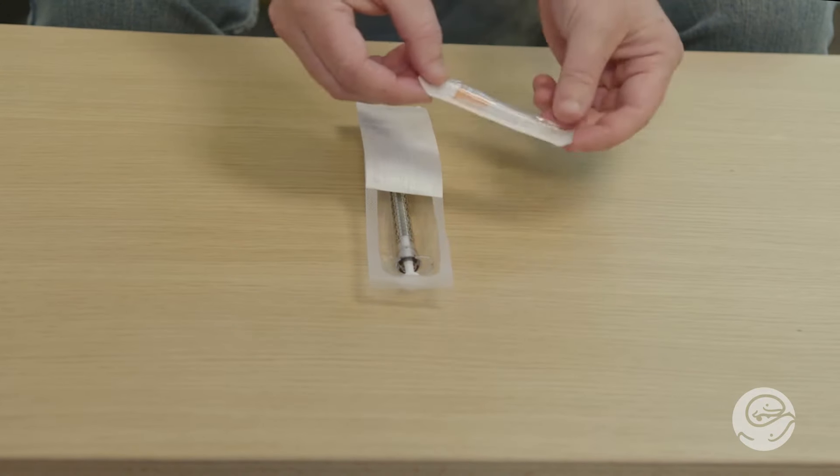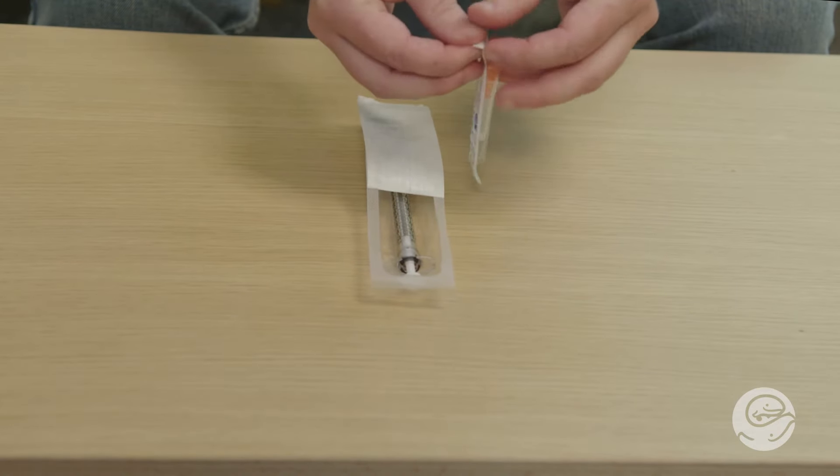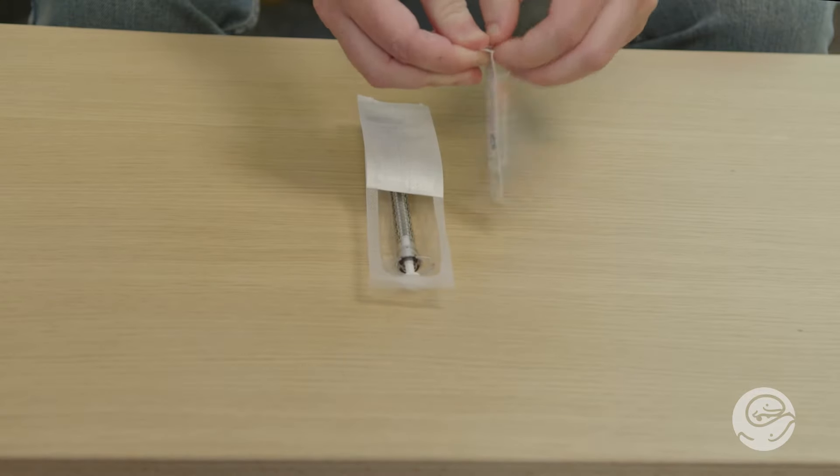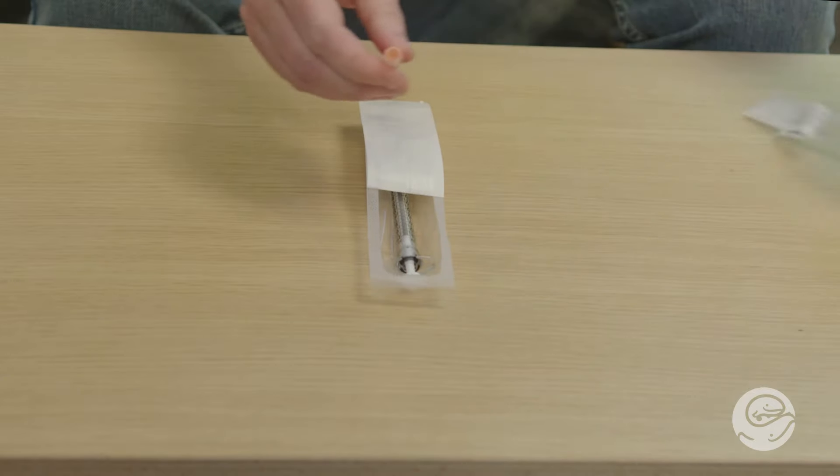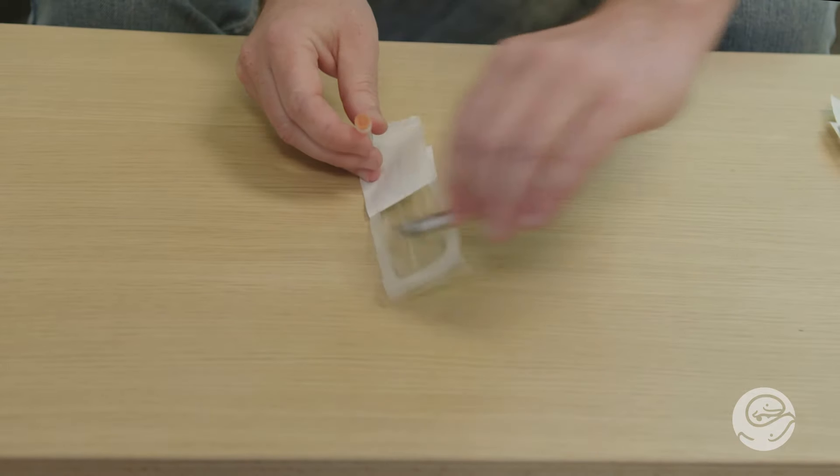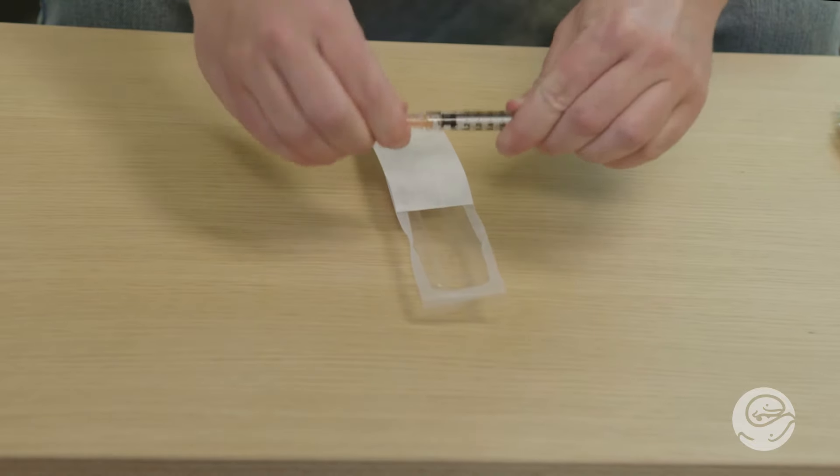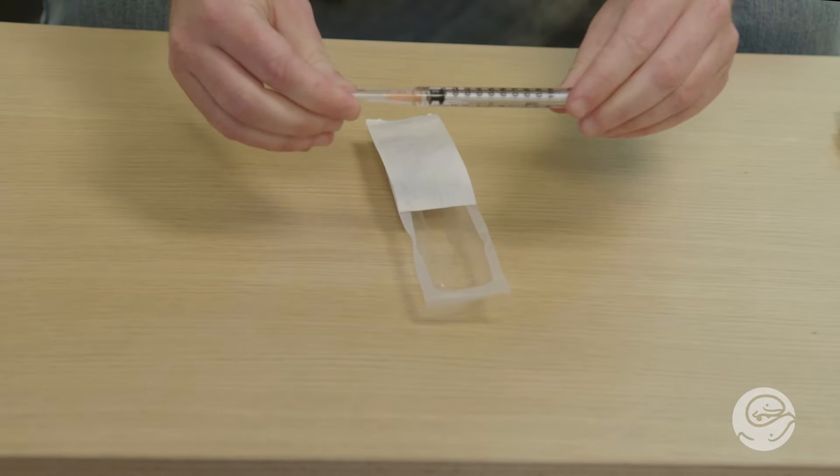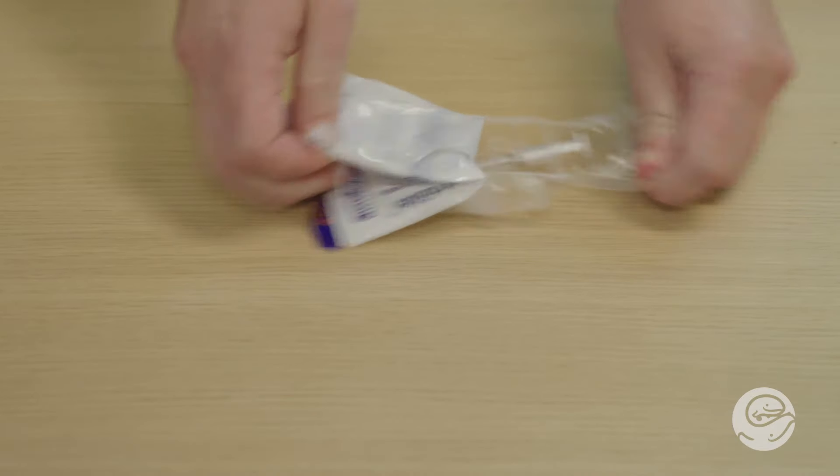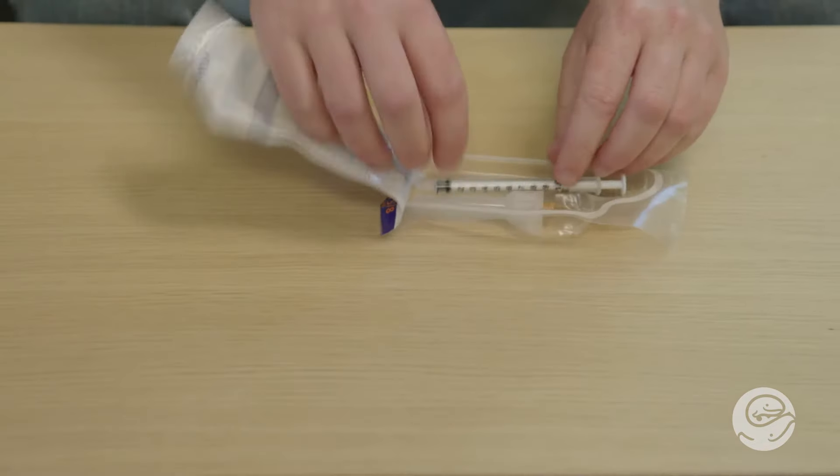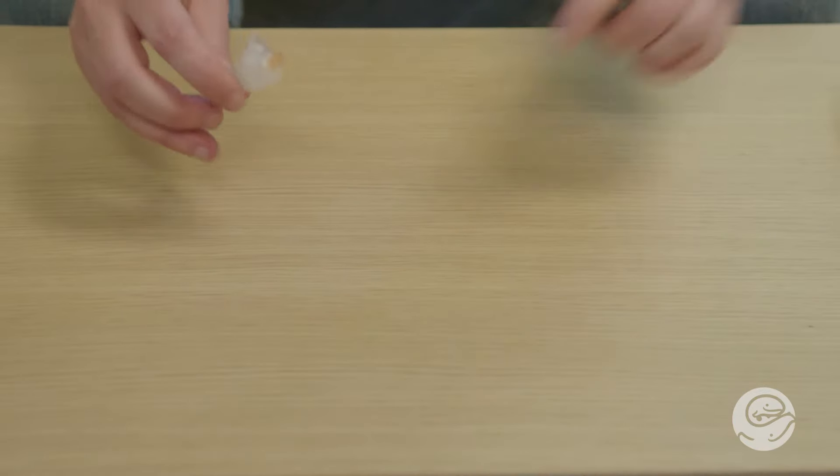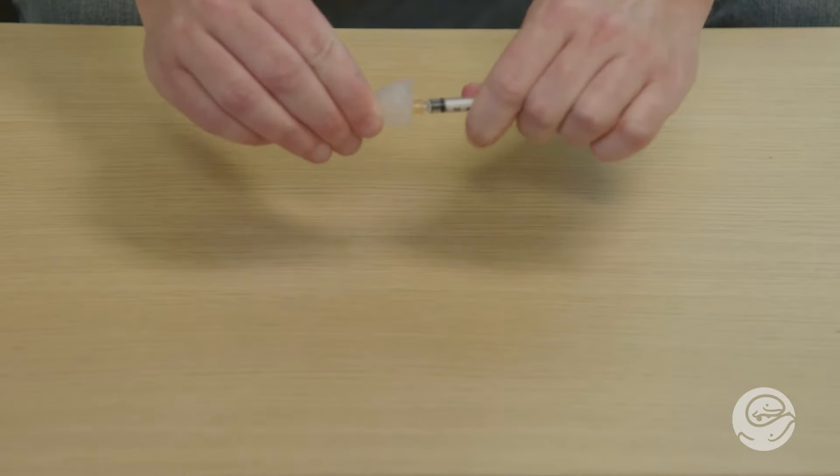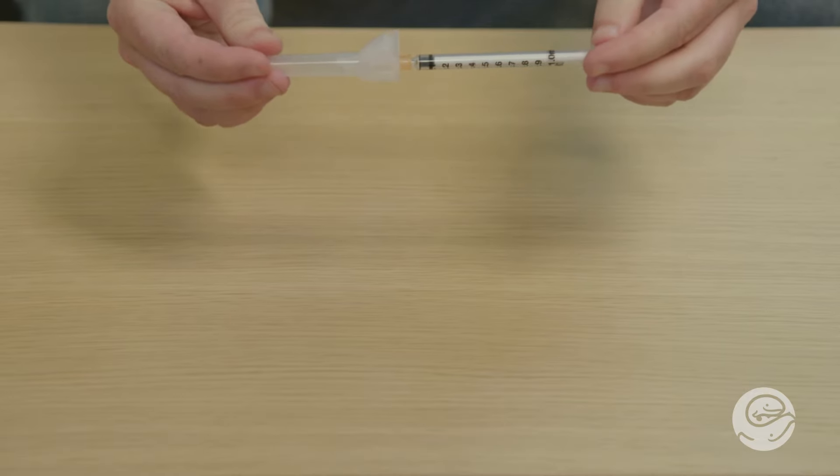Prepare your dose. If your 25 gauge 5/8 inch needle and 1 mL syringe are separate, remove them from the sterile packaging, and connect them. Do not uncap the needle. There are two different types of connections for syringes. A Luer Lock that twists into the needle connection, or a Slip Tip that you simply push together. Both are okay to use. Your needle and syringe may also come as one unit. Either way is okay. Just make sure the needle size is correct.